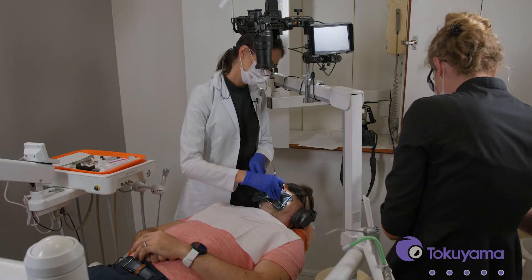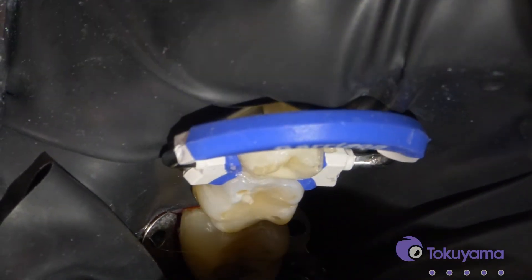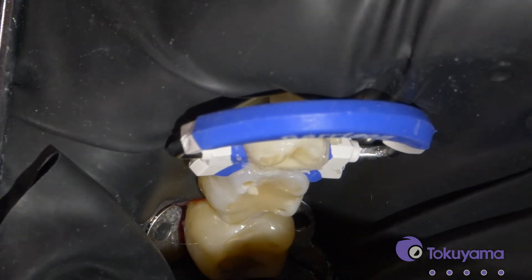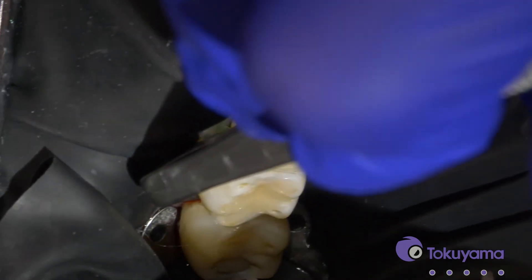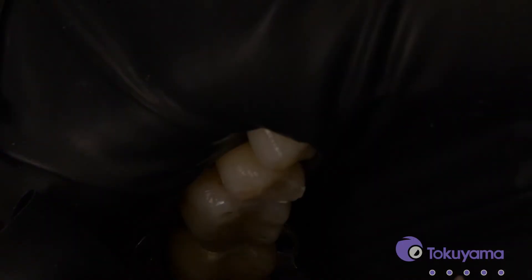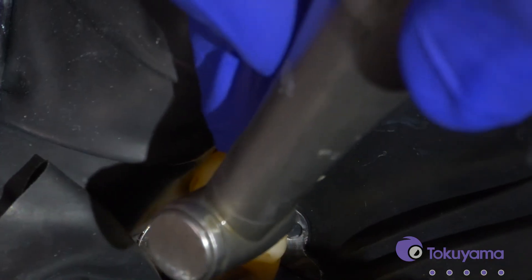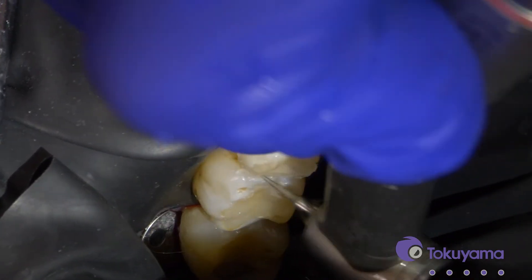I'm going to put the final layer on and cure that. We're all done — let's remove and see what we've got. Just a little bit of pull. We've got a nice contact. Look how nice that looks. We're going to start polishing now. I like to use this mosquito bur to go around the contour and get these little flyaways — that's usually my first step.